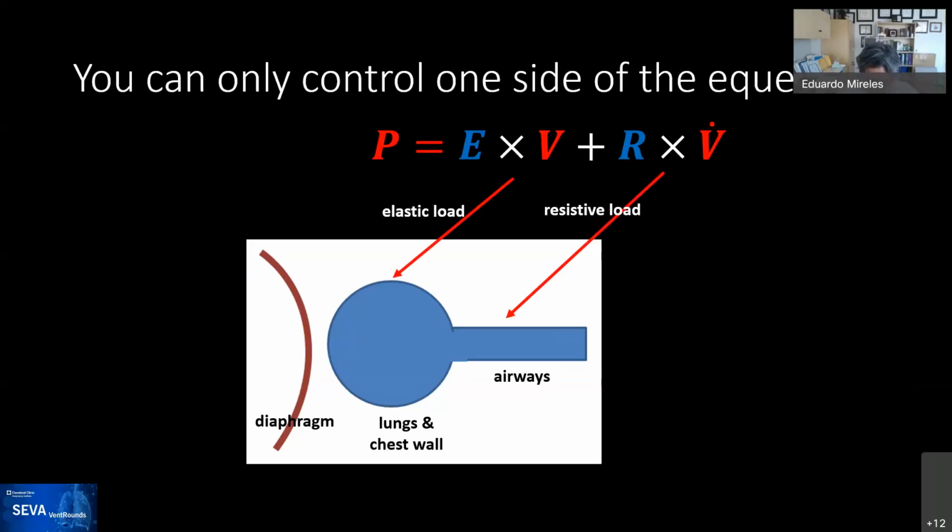Historically, respiratory care, and I would say pulmonary physicians in general, have thought of modes of ventilation as being either some form of volume control or pressure control, because the way it evolved, people could either set a tidal volume and the patient would always get it, or you would set some kind of inspiratory pressure and the patient would always get that. But as ventilators and modes have evolved, we need a little bit more precise definition.